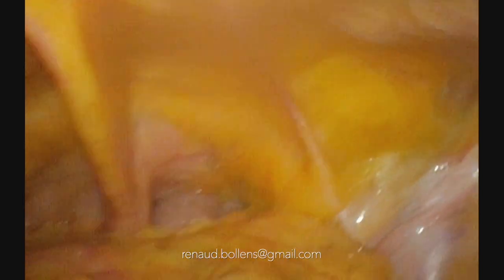I know that my epigastric is just under this one.